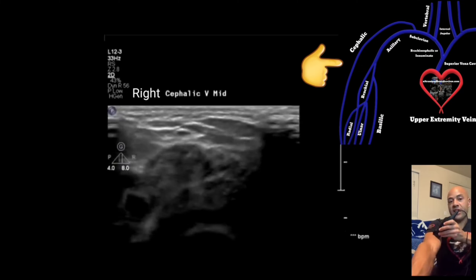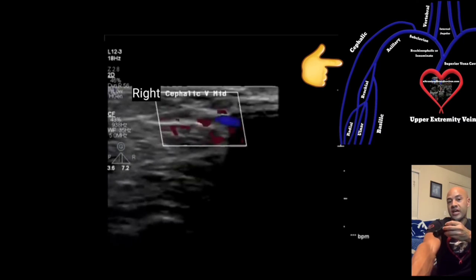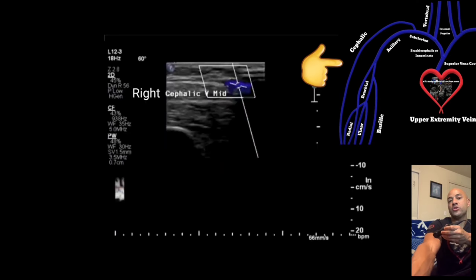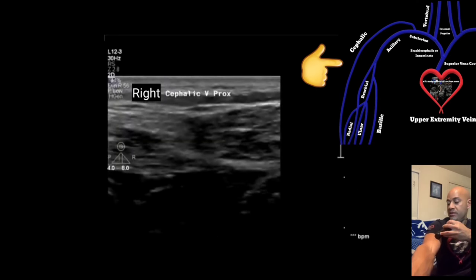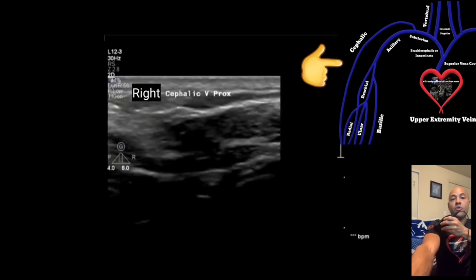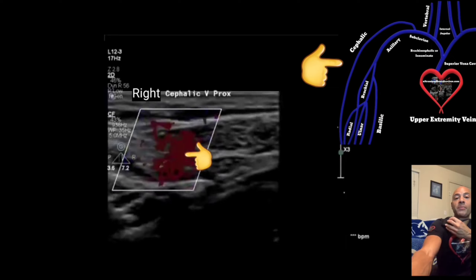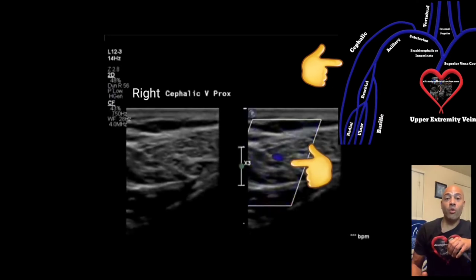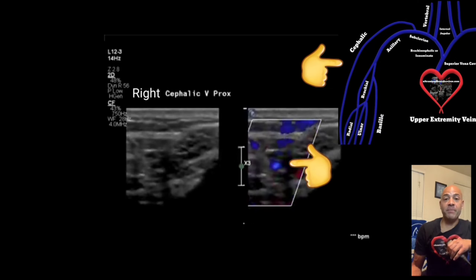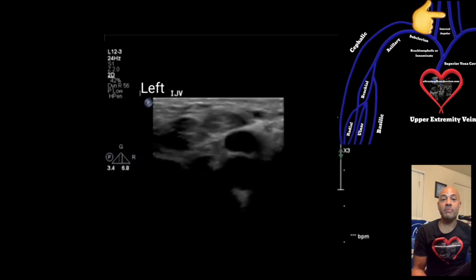Next, move your transducer to the upper arm just above the elbow in the transverse view and acquire an image compressing the cephalic vein. Then move to the mid cephalic vein and compress in the transverse view. Turn your transducer to the sagittal view with your index pointed towards the patient's head, and acquire an image with color and spectral Doppler waveforms. Then return to the transverse view and move to the proximal cephalic vein, trying to follow it as it dumps into the subclavian vein. Make sure you evaluate the cephalic vein thoroughly, as this is where clots are most commonly found.